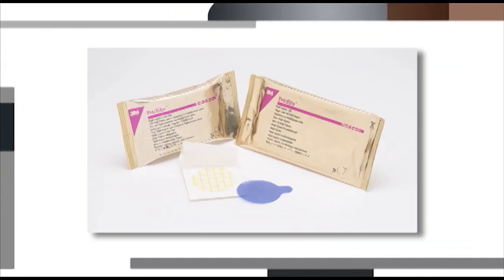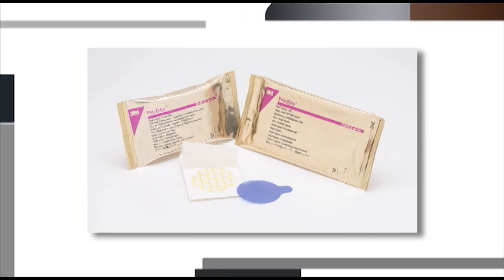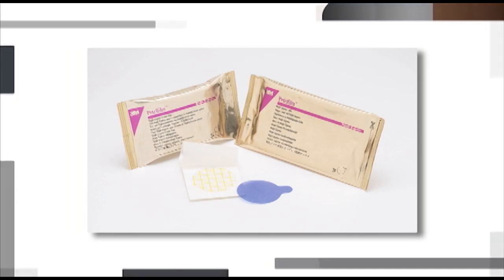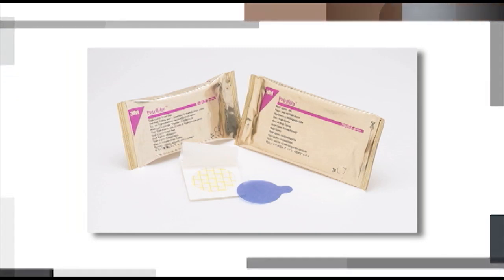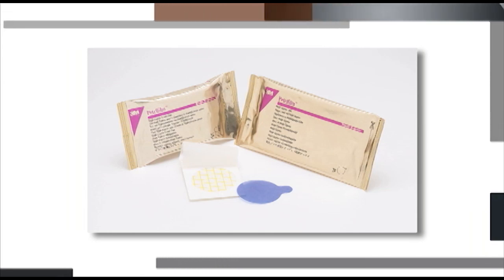The 3M PetriFilm Staff Express Count Plate and Disc consists of two parts: the plate itself, which contains chromogenic, modified Baird-Parker nutrients and a gelling agent, and the Staff Express Disc to facilitate differentiation of Staph aureus from other suspect colonies when background microflora are present.